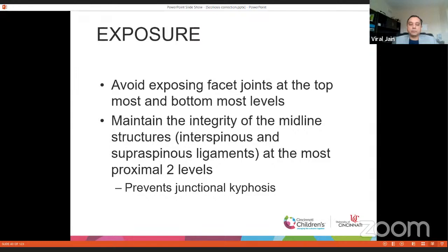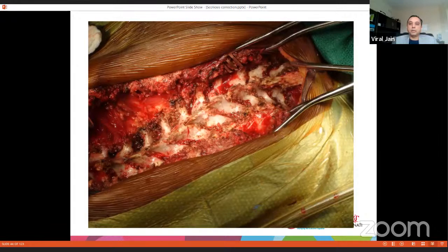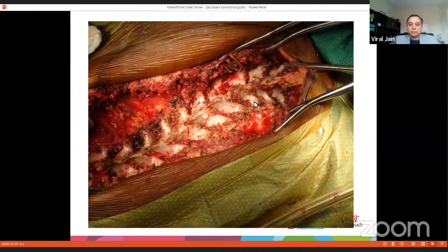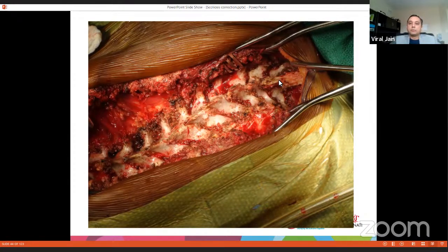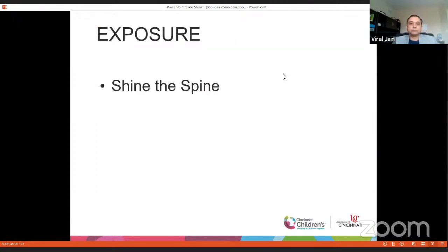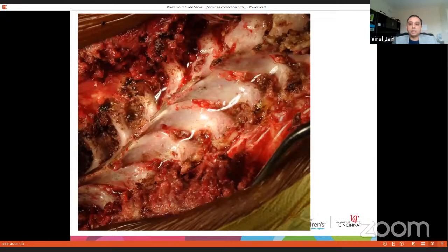Maintain the integrity of the midline structures at those two levels — it prevents junctional kyphosis both proximally and distally. As you can see in this example, the midline ligaments are intact at the very proximal level. My mentor used to say 'shine the spine' — essentially cleaning the spine of any soft tissues, which will help later on with fusion.